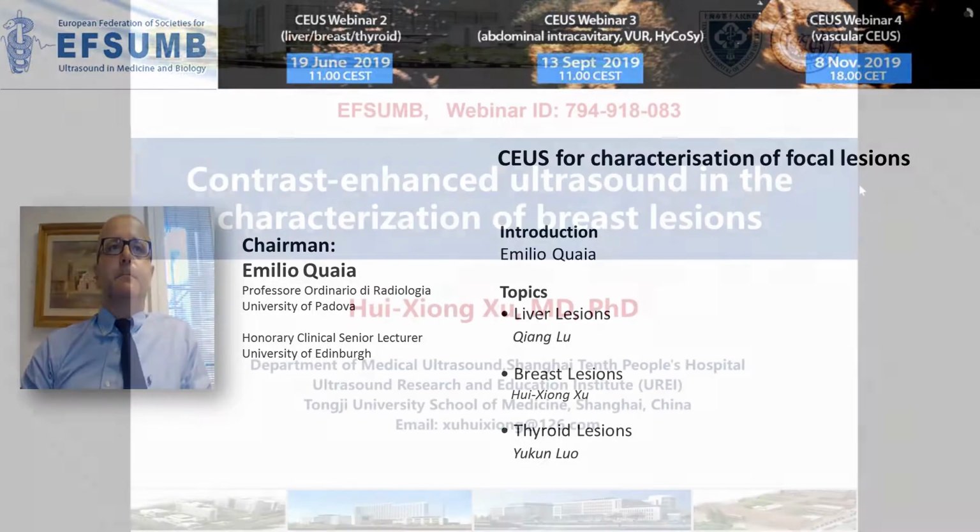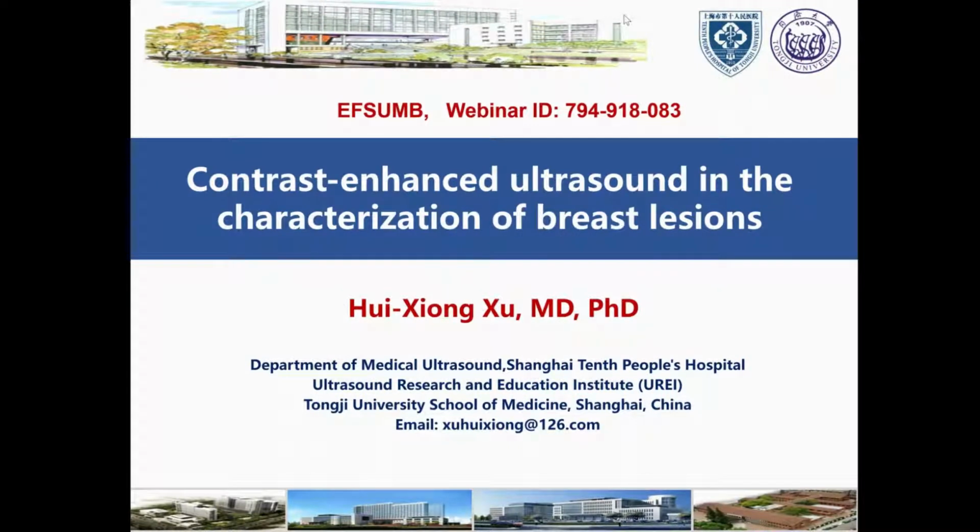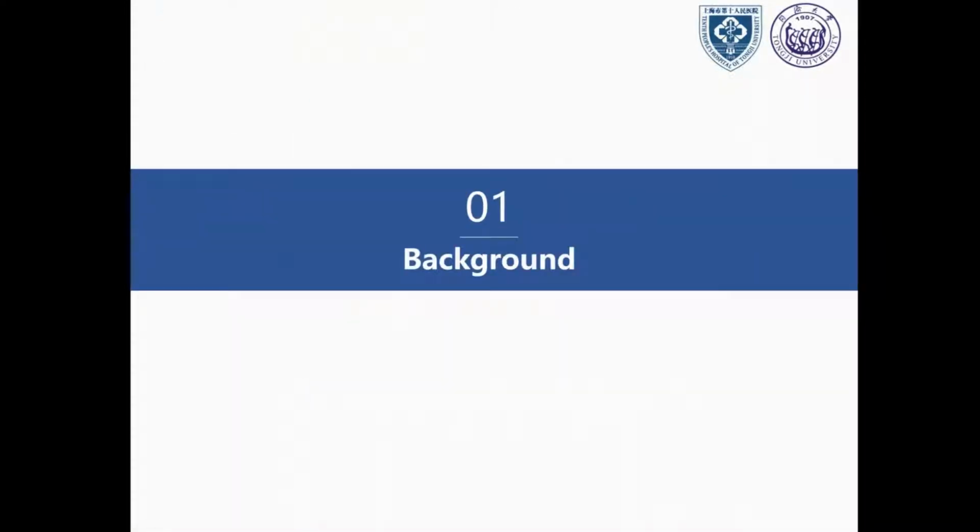Okay, I'm Dr. Xu from Shanghai, and it's my great honor to give a presentation here. The topic of mine is contrast enhanced ultrasound in characterization of breast lesions. So, firstly, background.